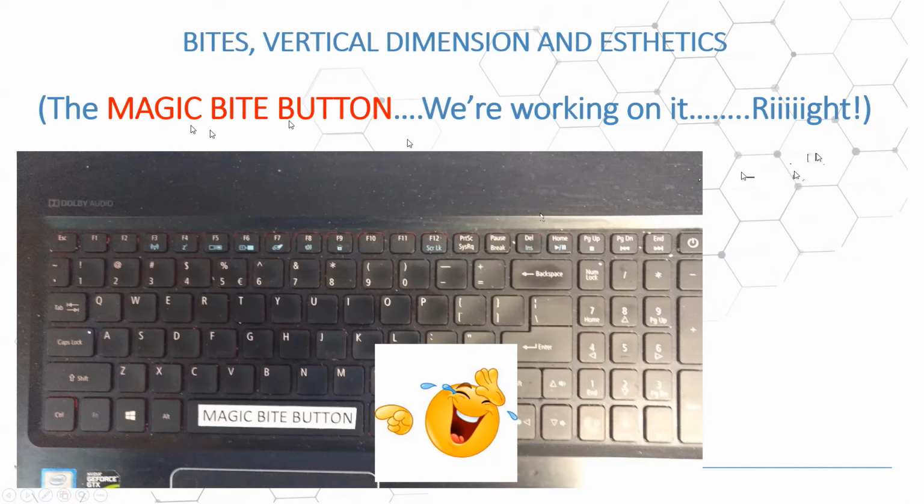At surgery, you're going to have a reasonable occlusion. And we don't guarantee occlusion on cases like that, or we can't tell them that we're going to have an occlusion that works until they give us all these confirmed bites, vertical dimension records. So we kind of disclaim it at that point if they want to continue, and we're happy to continue as long as they say that they feel good about the bite they've sent us.